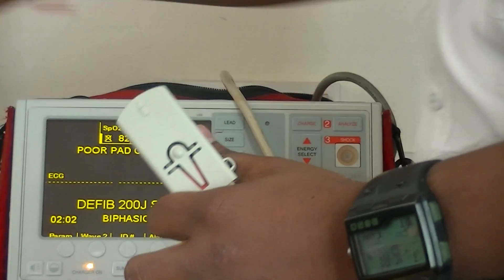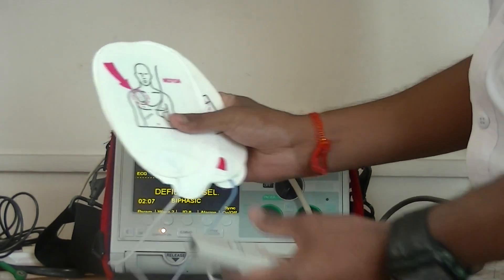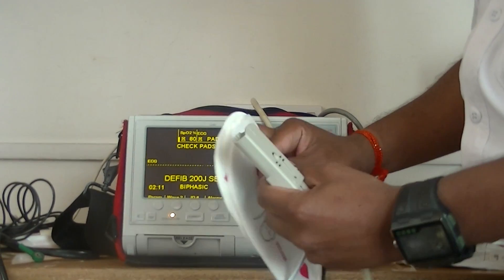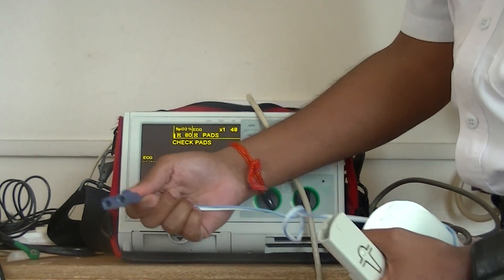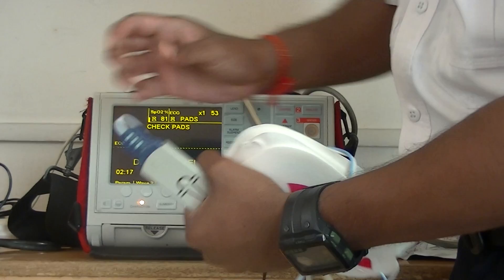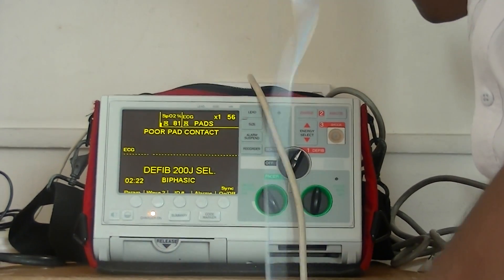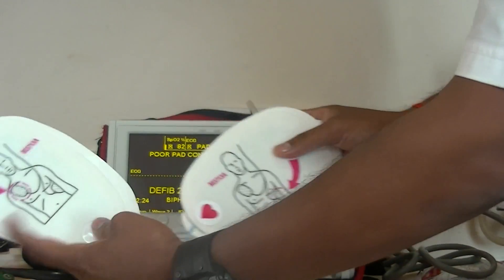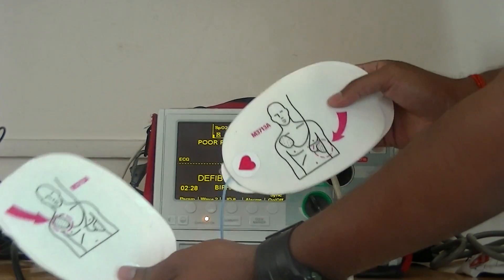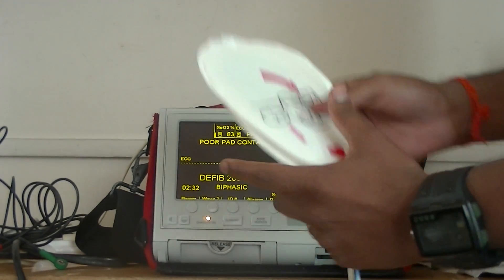Once I attach this, the Zoll pads will come like this, where the connectors will be attached with the Philips connector. As per the pictures drawn on the pads, attach one on the patient's chest at the sternum, and this one goes on the patient's apex.